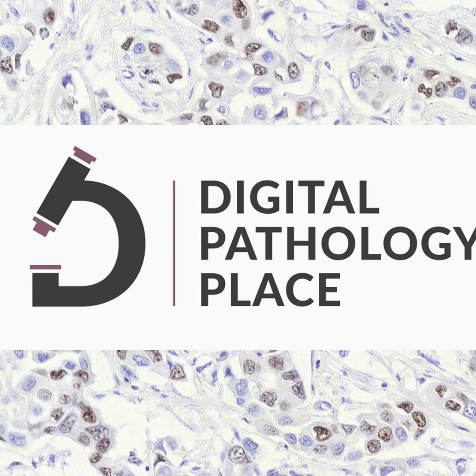C. Education and training, resident and student training, and continuing medical education. Digital pathology has emerged as an influential tool in medical education and training, particularly for pathology residents and students. Through digital platforms, students and residents can access a rich archive of high-resolution slide images that encompass a wide variety of diseases, thereby supplementing their learning with extensive real-world examples.